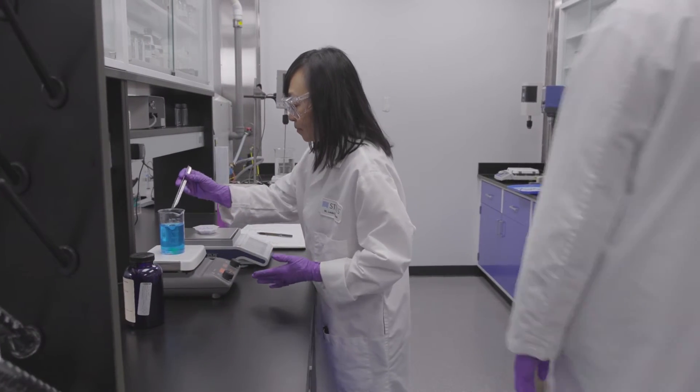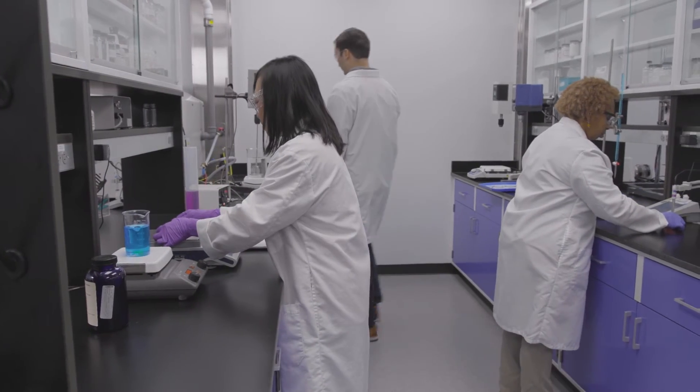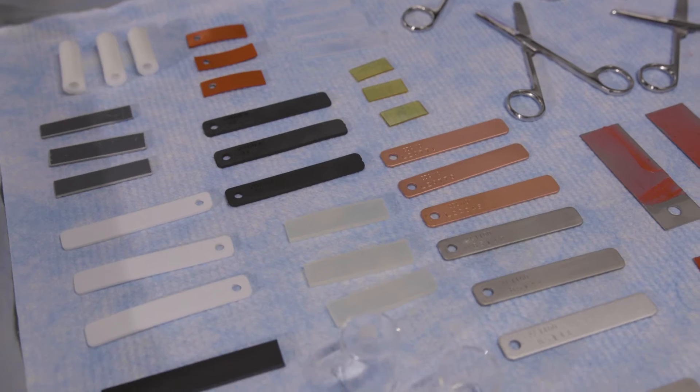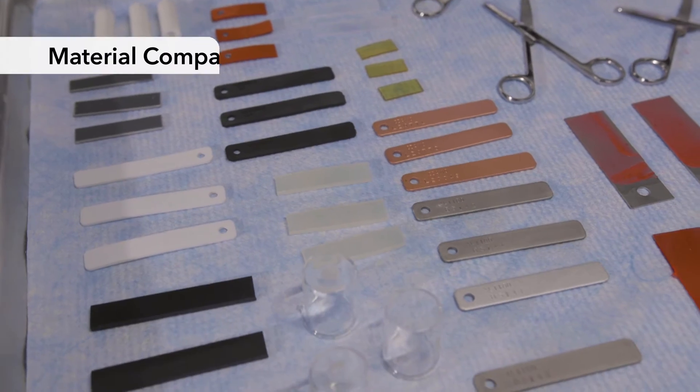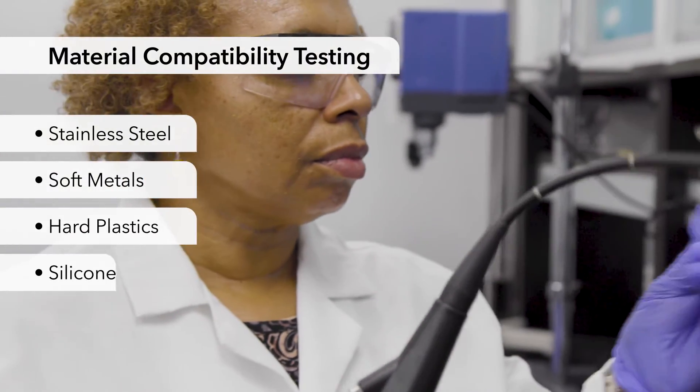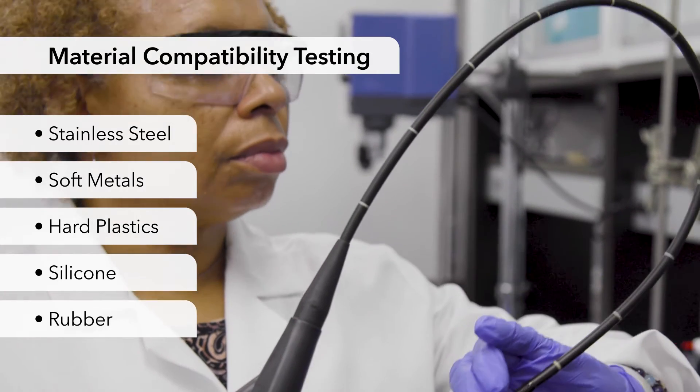At Starris, as we develop a chemistry, we conduct material substrate compatibility testing on more than 50 different types of materials, ranging from stainless steel to soft metals, hard plastics, silicone and rubber, and multiple types of tubing. To ensure protection, Prolistica chemistries are formulated with mild ingredients, providing compatibility with a range of instrument substrates.